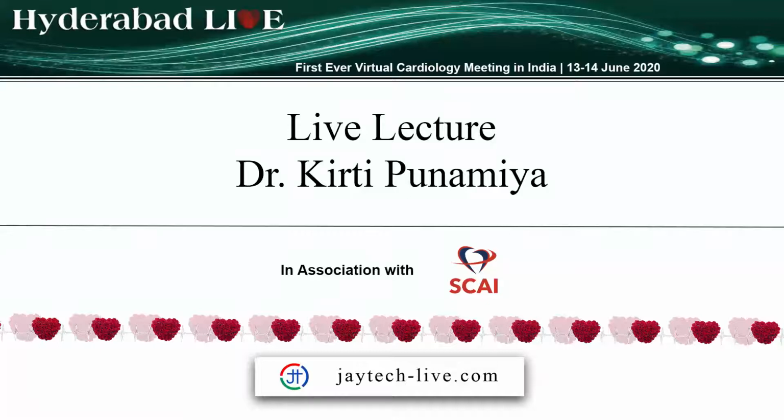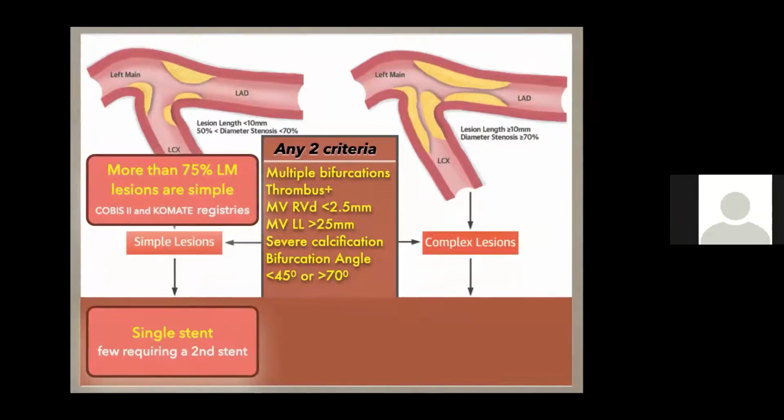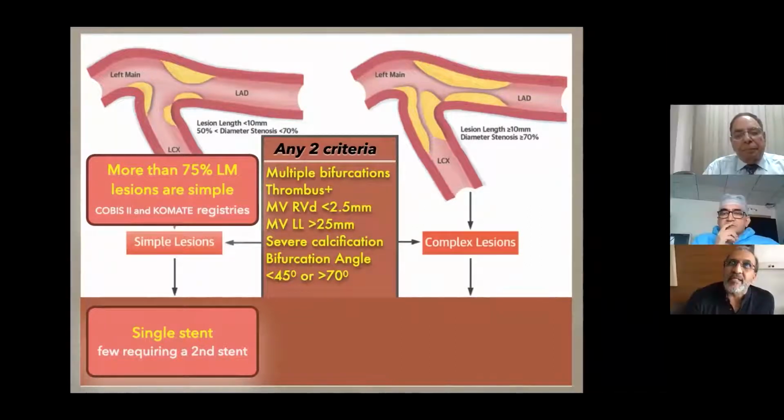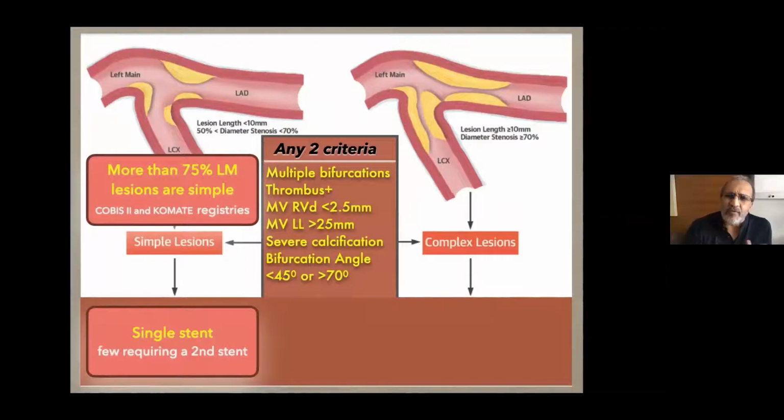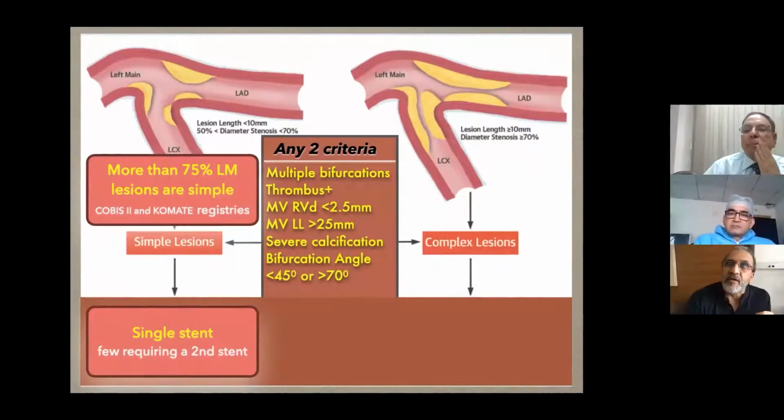Out with a single stent technique, and very few require a second stent. If I look at my own data, when I look at my own practice patterns around 15 years ago, I almost indiscriminately used 2 stents in these areas. And a large part of those patients, if I had to redo them again, I might not have put in a second stent. And I think this is a change in practice, this is a change in philosophy.